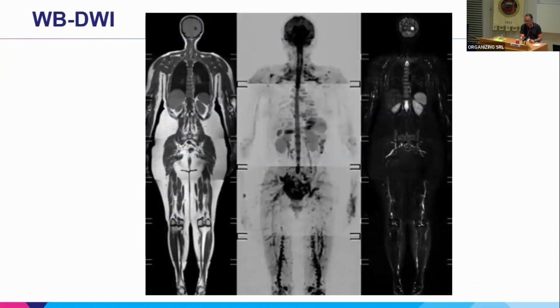This is just an example of whole body MR using whole body diffusion, or DWIBS. This is using inverted high diffusion, high b-value diffusion, and you can really do a whole body acquisition from pretty much head to toe. We've been using this, for example, for multiple myeloma cases, but also for prostate cancer. This could be combined with PET imaging when we use PET MRI. So it really maximizes the information about bone metastases, lymph node metastases, and potentially for lung nodule characterization.